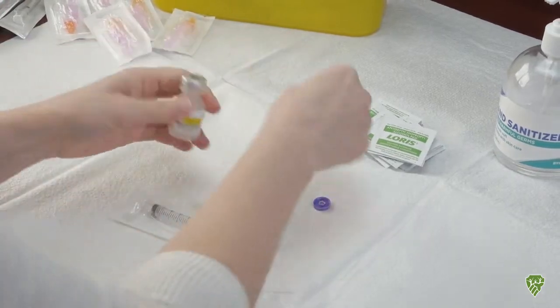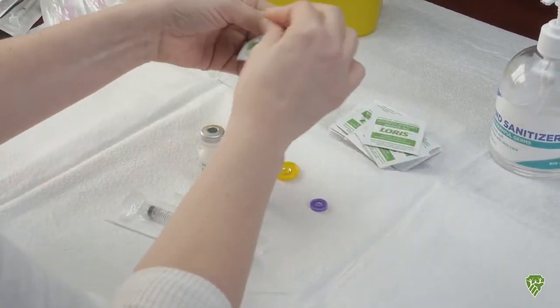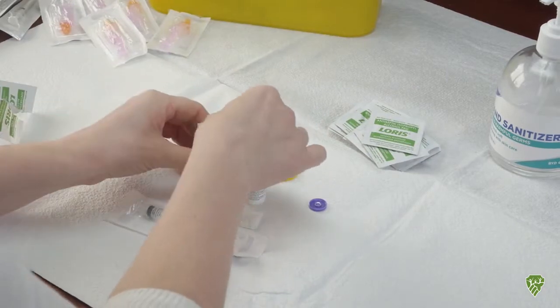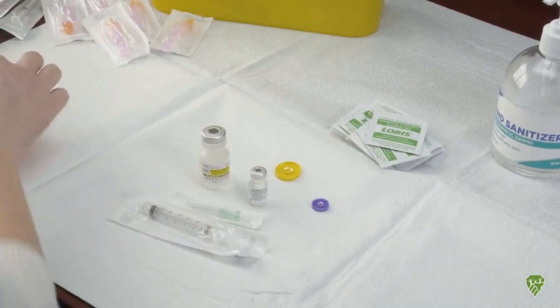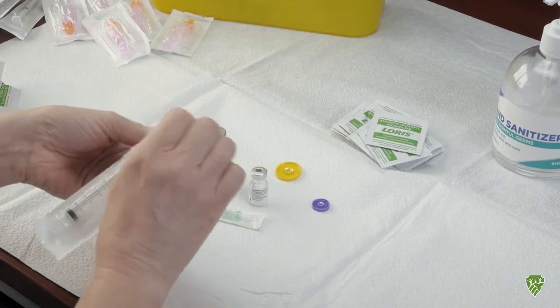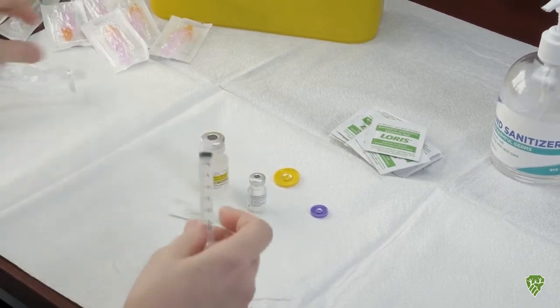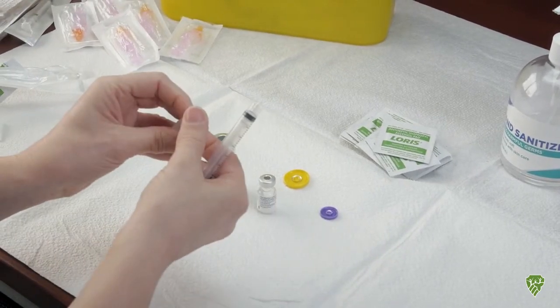And then doing the same thing for the vial of diluent with a new alcohol swab. Now I want to let those vials dry of alcohol and I'll prepare my syringe for the dilution.